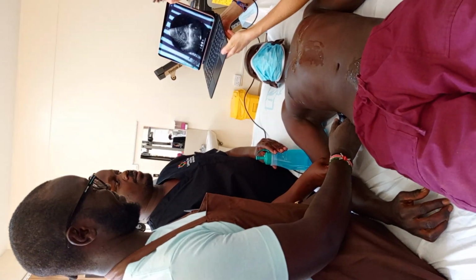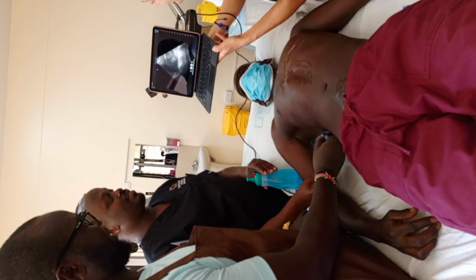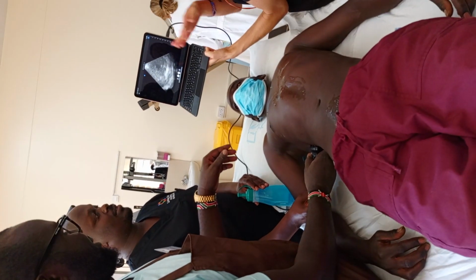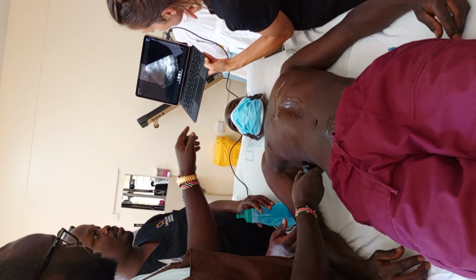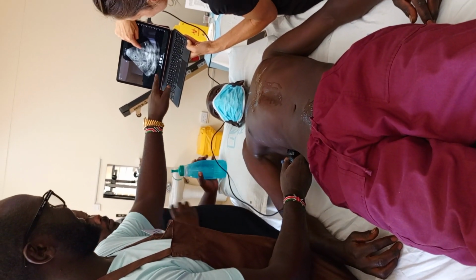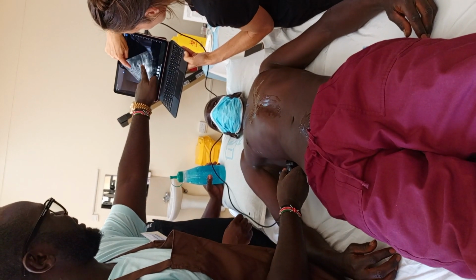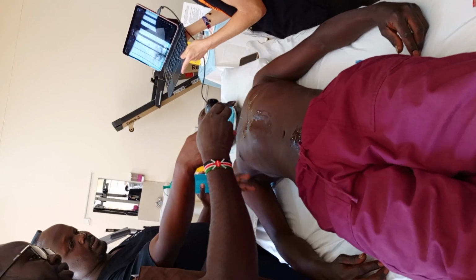Do you see what you want to see? Is that a good view to you? Do you like that view? Okay, where is the kidney? Here, you ultrasound, I'll point to something, you tell me what it is. Okay, what's that? What's that? What's that? Love it. All right, to the subxiphoid.